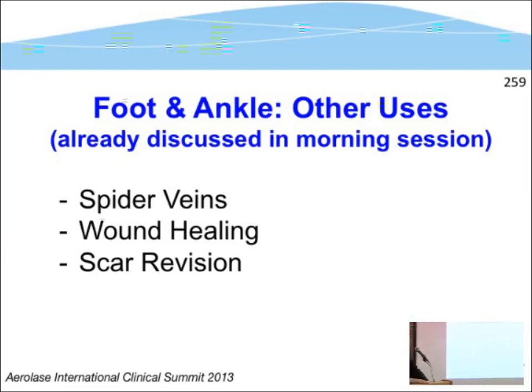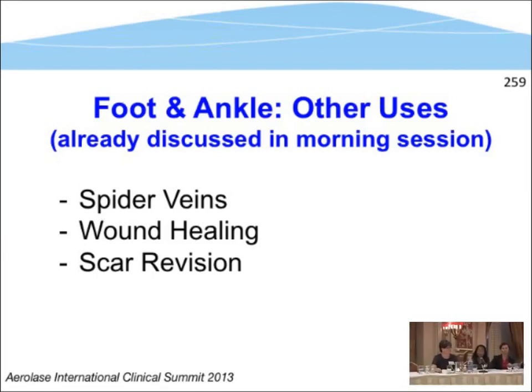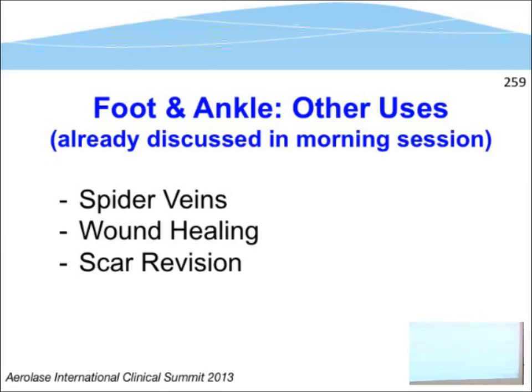Yeah, I've used it. You do? Periphery often. Periphery? What settings? Just like facial rejuvenation. The gentleman over here says your name is? Dugarala. Dr. Dugarala? Yes. Sorry, mispronouncing it. Maryland. Good. He uses the settings for photo rejuvenation on the wound. Not on the wound itself, but the periphery around the wound. Yeah, both of us.